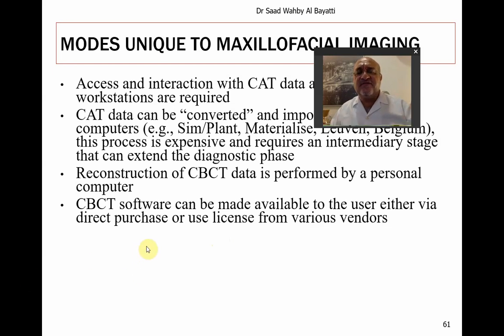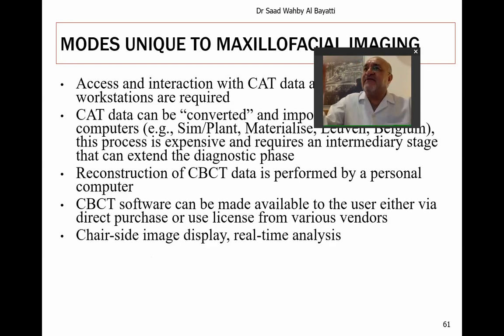The CBCT software can be made available to the user either via direct purchase or use license. It depends how much you pay actually. Companies can give you the whole package of software that enables you to do all the programs that you need for dental use, dental surgical use.